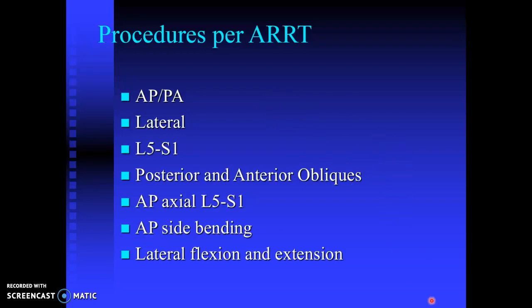Per the ARRT, we will cover the following positions or projections: the AP-PA, the lateral, the L5-S1 spot shot, the posterior and anterior obliques, the AP axial L5-S1 interspace, AP side bending, and the lateral flexion and extension.